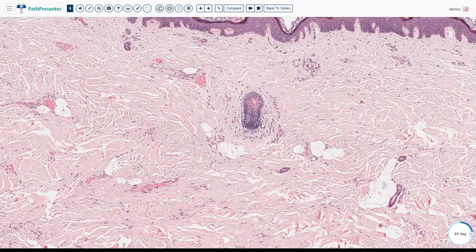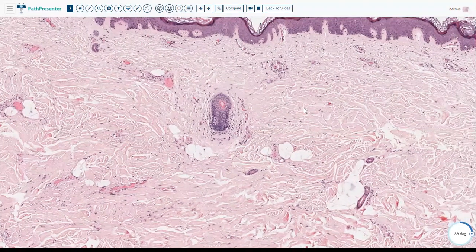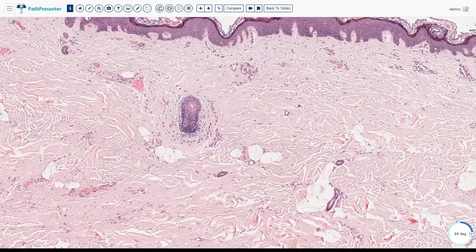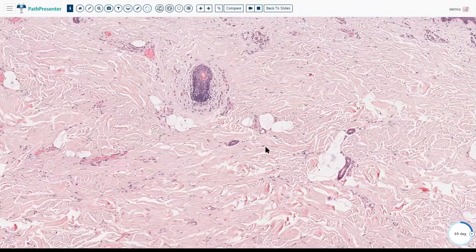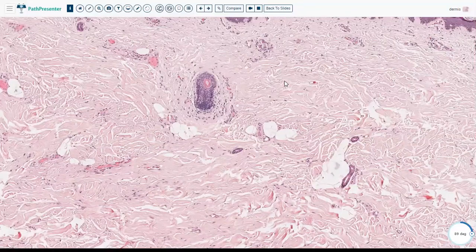Starting with collagen — collagen makes up at least 80 to 85% of the dermis. It gives the skin its strength, rigidity, and integrity. It appears, as you can see here, as fibers mostly running east to west. They gain thickness as they go deeper toward the lower layers of the reticular dermis.